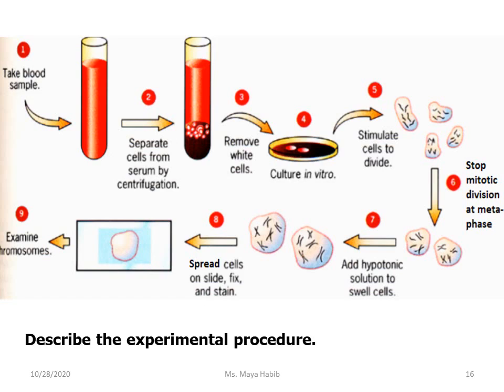Now let us see the role of the hypotonic solution. When we say hypotonic solution, we mean a solution that has a concentration lower than the concentration of the fluid found within our cell. According to the law of physics, water will move into the cell and the cell will be filled with water and will swell, that is increase in volume, so that we can better see the chromosomes inside the swollen cell.